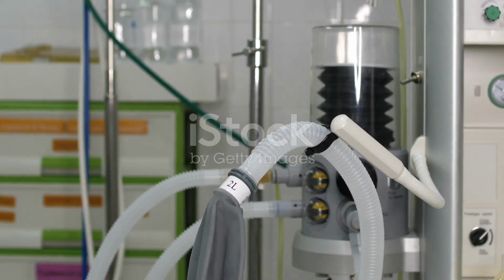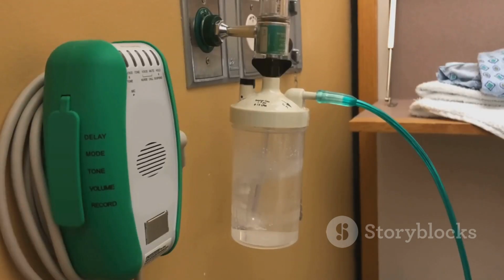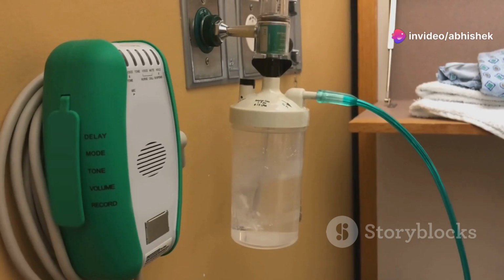Let's start with the gas delivery system, the foundation of the anesthesia machine. This system includes those big cylinders you often see attached to the machine. Those contain the primary gases we use, like oxygen and nitrous oxide. We're talking pure medical-grade oxygen here, folks, the lifeblood of our patients while they're under anesthesia.